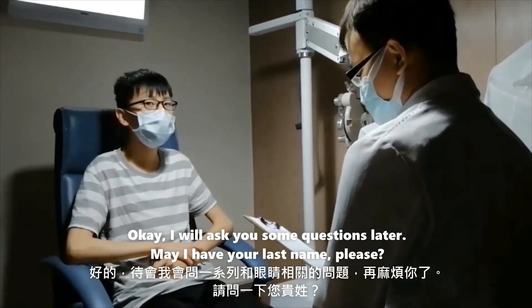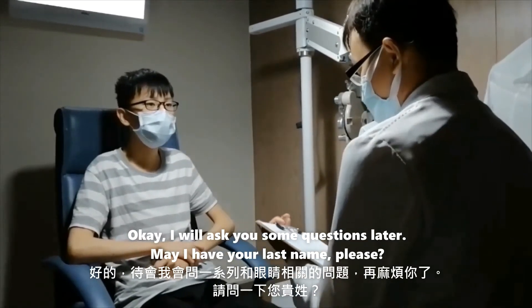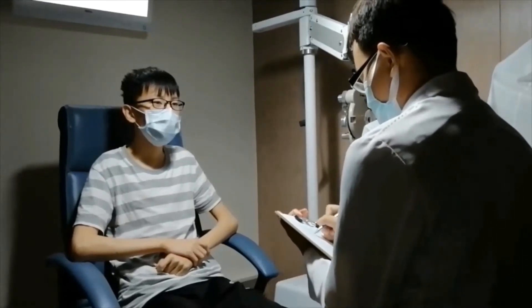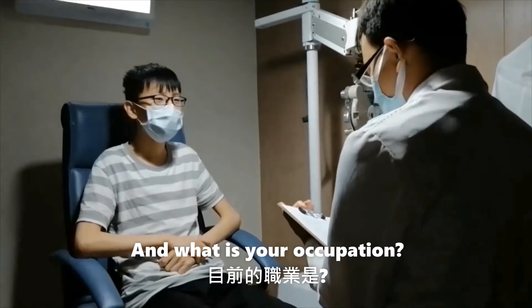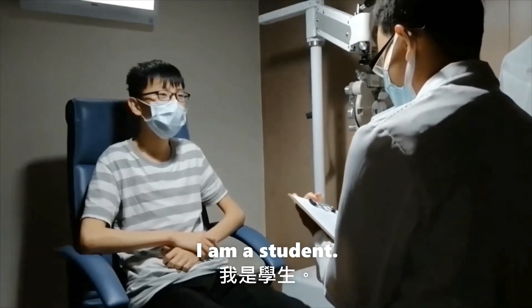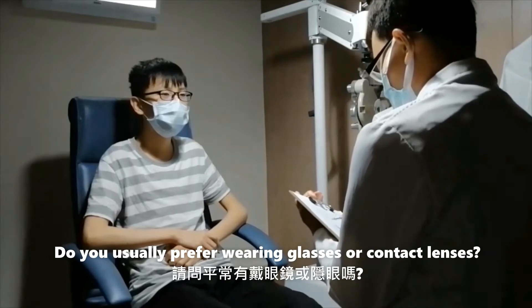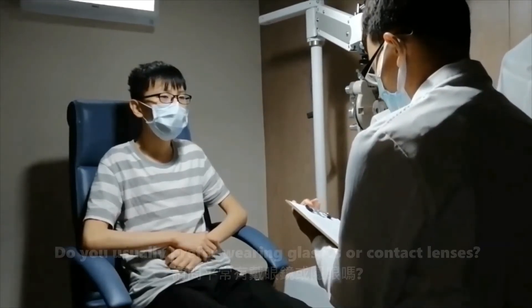Okay, I will ask you some questions later. May I have your last name please? My name is Jack. And what is your occupation? I'm a student. Do you usually prefer wearing glasses or contact lens?